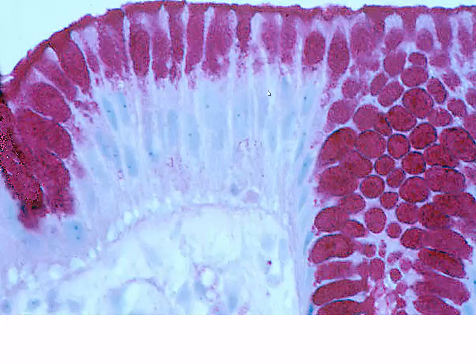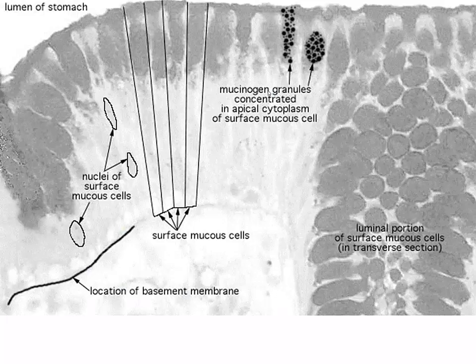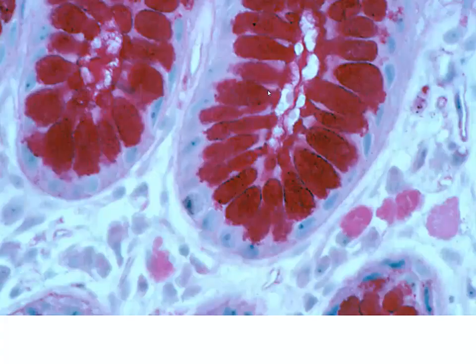Again, looking more closely there, you can see all of the mucinogen granules that are present in these cells, and you can see the mucin and the mucus that's at the very top, the apical surface of these cells. Just illustrating all of the mucus material that's being produced. And again, remember the visible mucus from the surface lining cells are protecting your stomach and the cells from autodigestion.